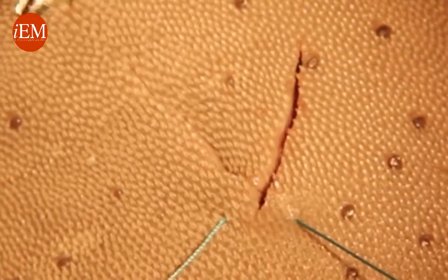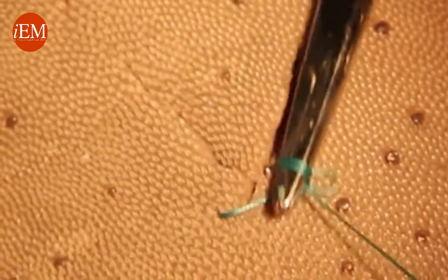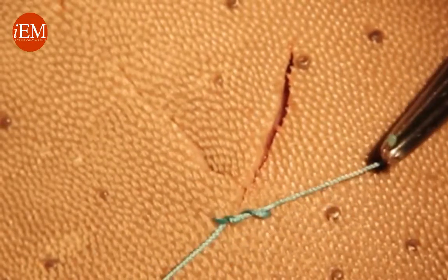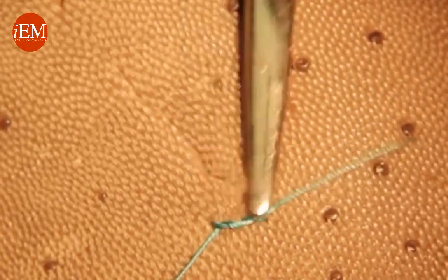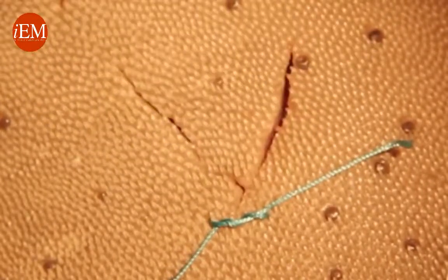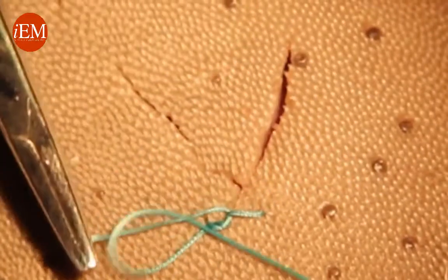Now we're going to tie the corner. We pull — just enough to have the corner fall in place — and tie the other throw to make the square knot.